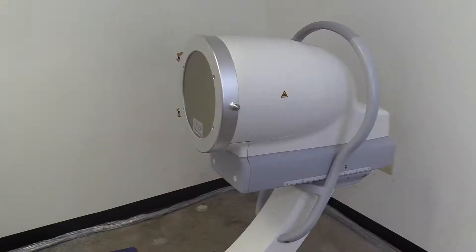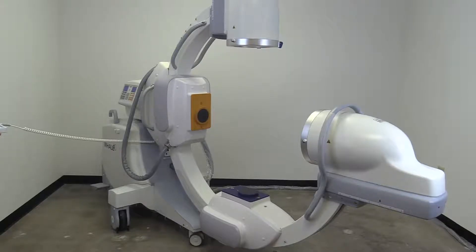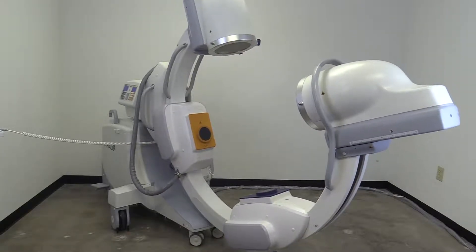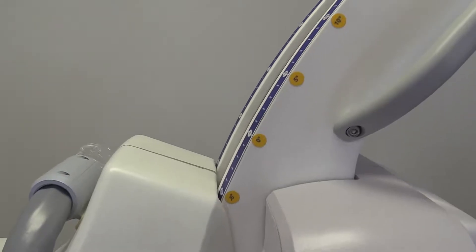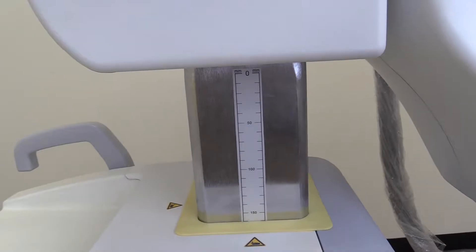You'll see arrow buttons to move the image intensifiers, both AP and lateral, closer or farther away from the patient. There are two more arrow buttons to adjust the orbital rotation of the unit and another set for the radial rotation. You can adjust the height of the system and there is a scale on the machine to see the exact height.